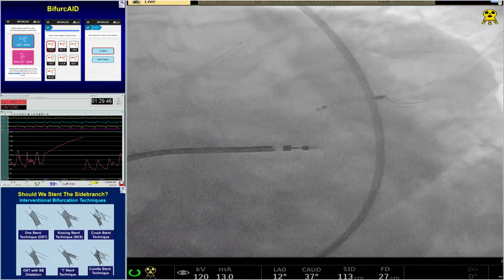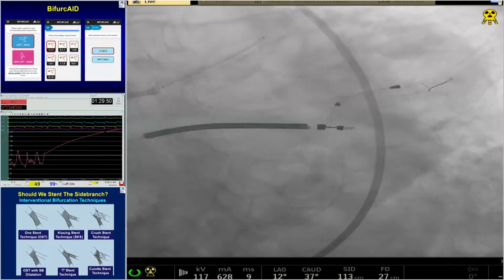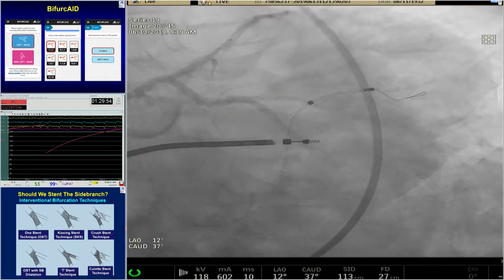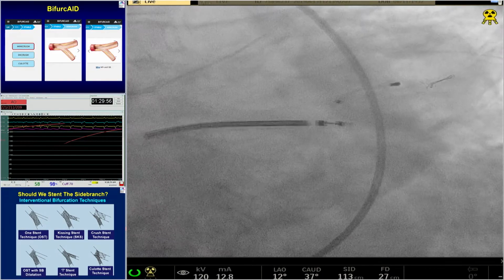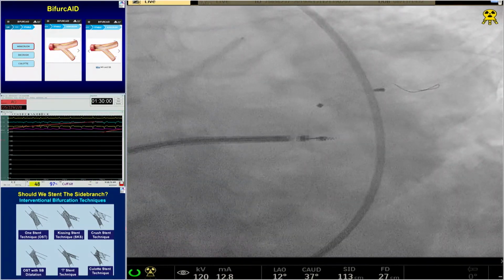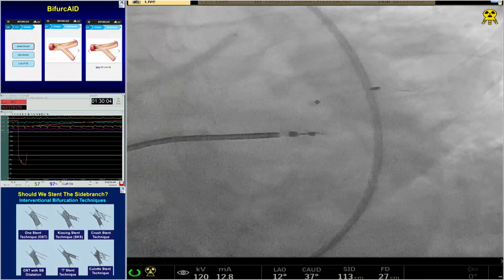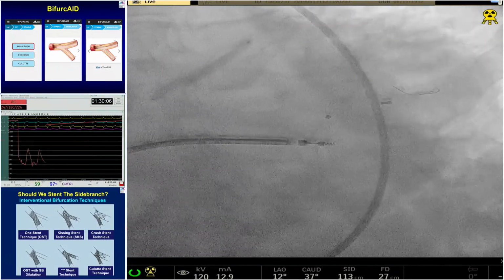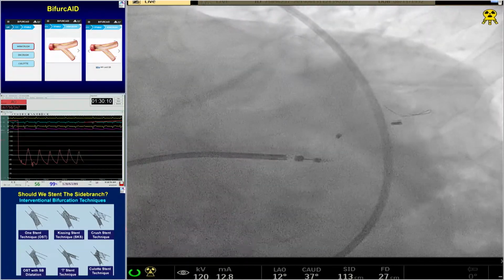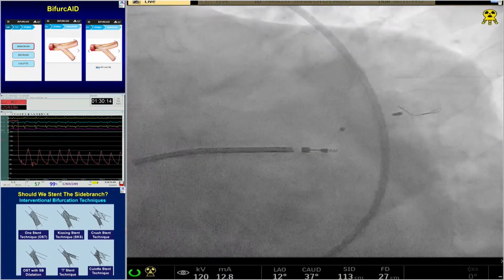So you take a cine so that they can see it. Yeah, show us the cine. So the stent has been placed. We're going to wire go up, removed. And after this, what we'll do is recross. But since this is a 3.5 stent, and the left main is almost 4.2, we'll have to do the POT of the left main, kiss, and then we are going to IVUS at the end. Go up again. Quick, quick, quick.